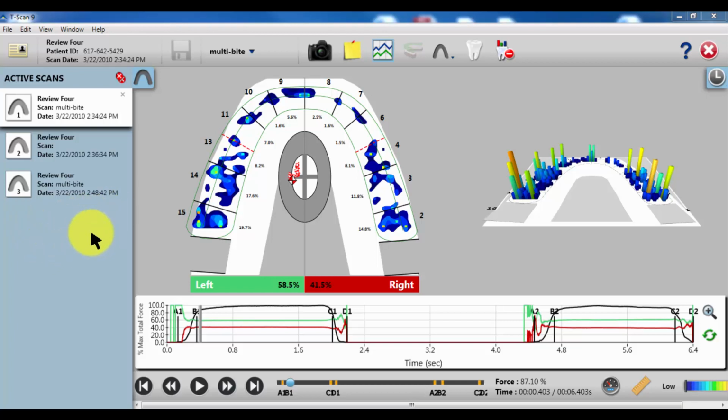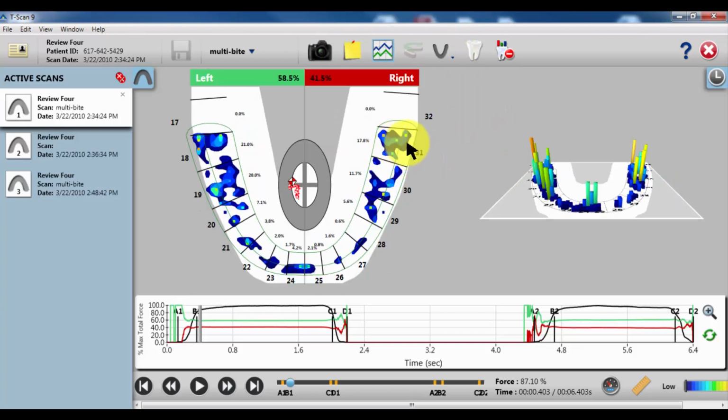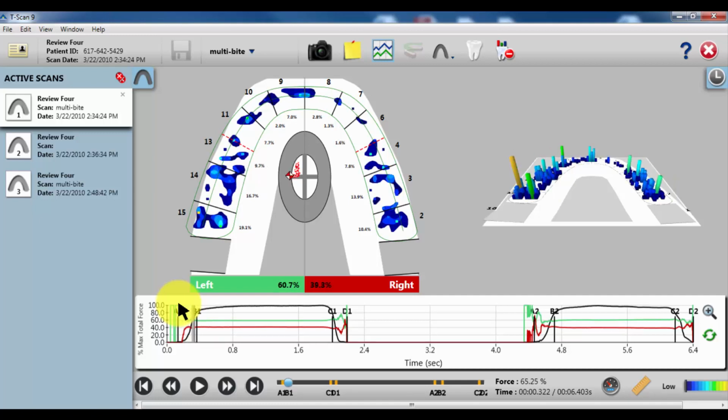So when a patient comes in, in this case the patient was complaining about a forceful, painful contact on 2, and if we flip the arch to the lower, 31. When they took the standard closure multi-bite like we normally do and proceeded through the A to B area, there wasn't any clear demonstration of forcefulness, especially since the forces are pretty low during the closure here. The highest force during the A to B area was a yellow, green, and a slight orange, which at this point in the movie is somewhat acceptable.